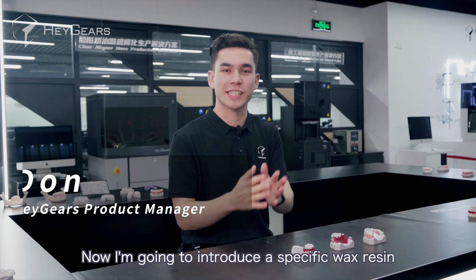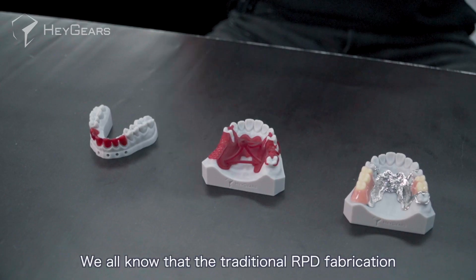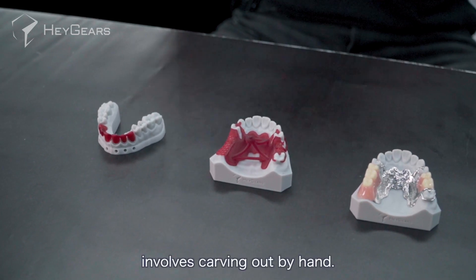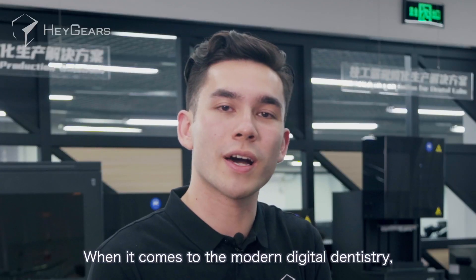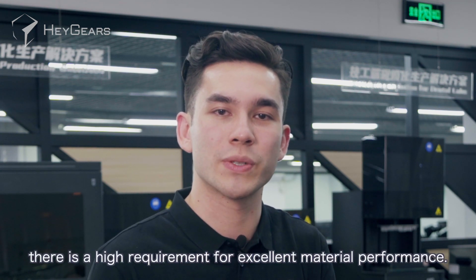I'm going to introduce a specific wax resin: Heygear's Dentsylcast. We all know that traditional RPD fabrication involves carving out by hand. When it comes to modern digital dentistry, there is a high requirement for excellent material performance.